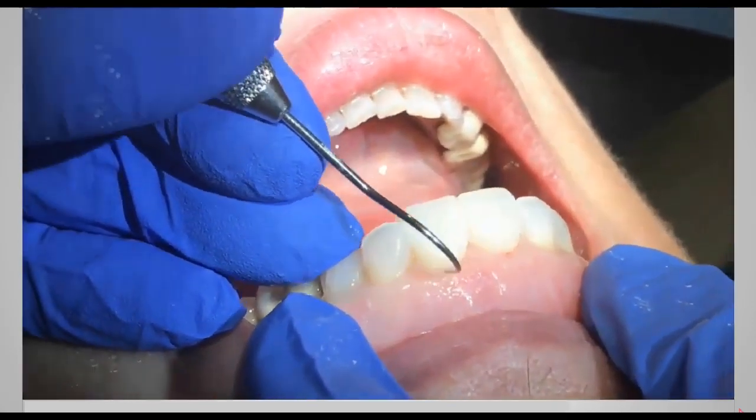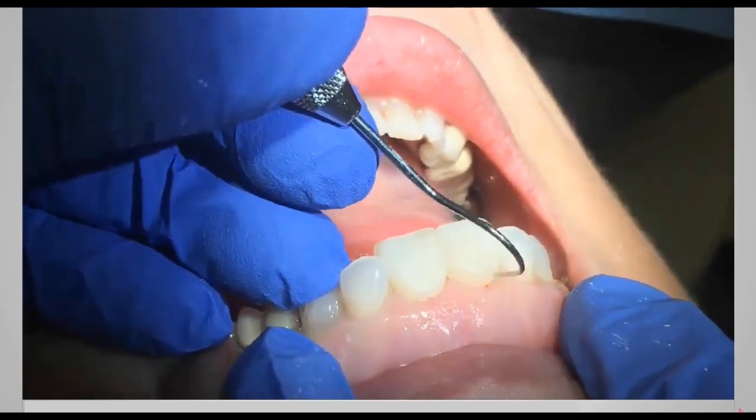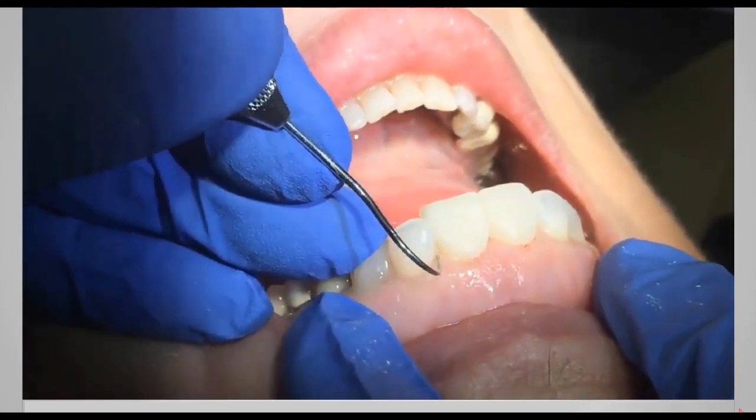And then we check the margins with the Explorer. You can see that there's no catch on the margins. Everything is nice and smooth. So there's a very nice transition. If you find any catch, you go back with the soft flex disc or with the burr and just go back and repolish. Very, very easy.